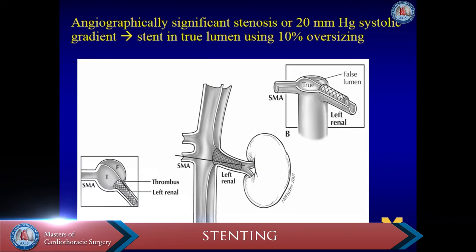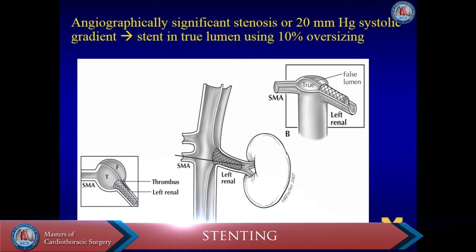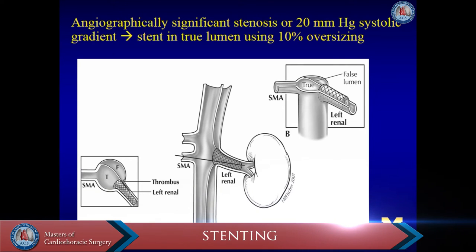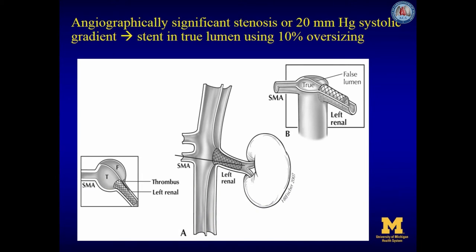In the event of angiographically significant stenosis or a measurement of a 20 mmHg systolic gradient, the renal true lumen is stented with a self-expanding stent with 10% oversizing. Completion manometry demonstrates branch vessel patency and adequate antegrade branch vessel flow. It is of major importance to look at these branches after you have covered the tear — you have to verify that these branches are perfused before you conclude the case.